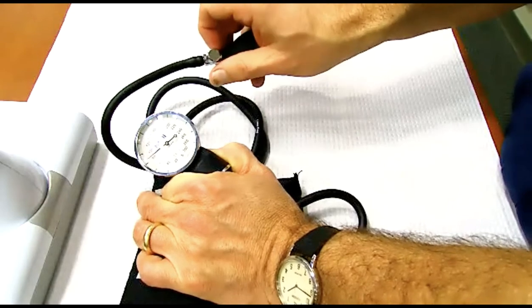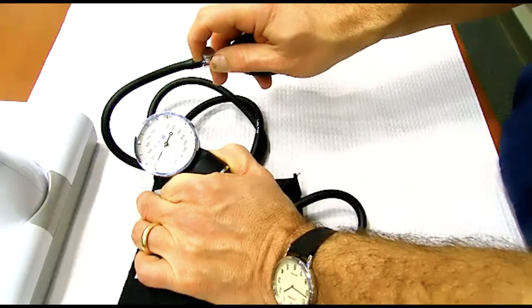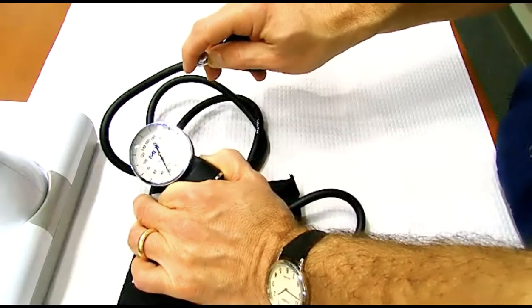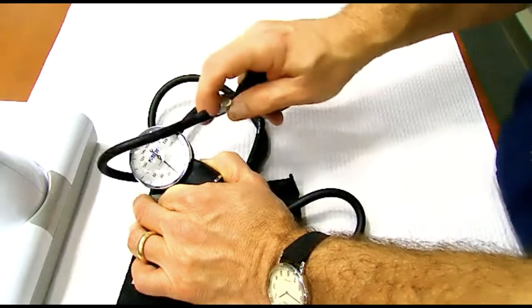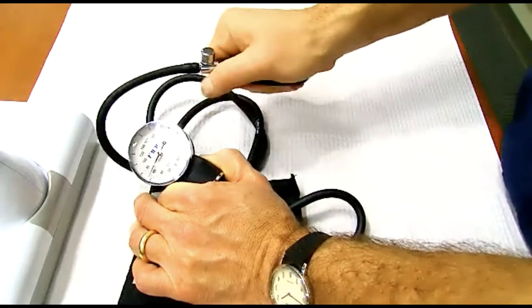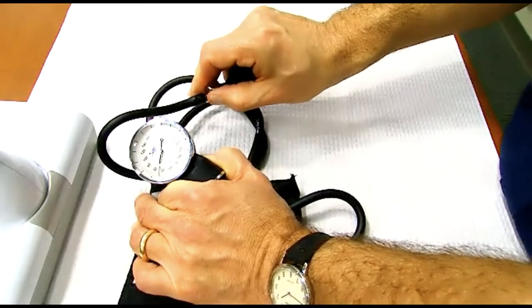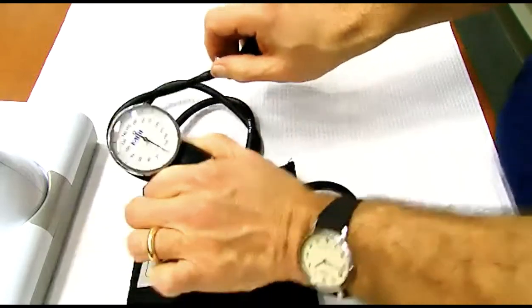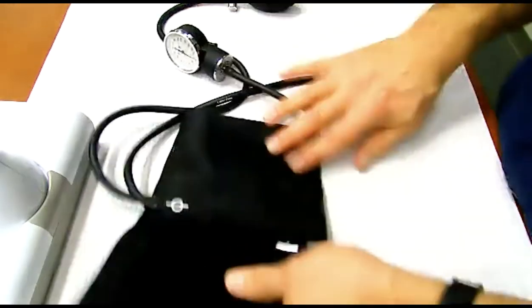Now to let the pressure out, I'm going to take my fingers here and go counterclockwise. And I don't know if you can hear the hissing and see the pressure valve start to go down, then it's going counterclockwise to release the pressure. So clockwise, lock it, pump it up. Counterclockwise, fingers, let the pressure out. There you have it. That's how you work and operate a blood pressure cuff, using the manometer and the bulb valve. Let's talk though about the actual blood pressure cuff itself, because this is the deal.